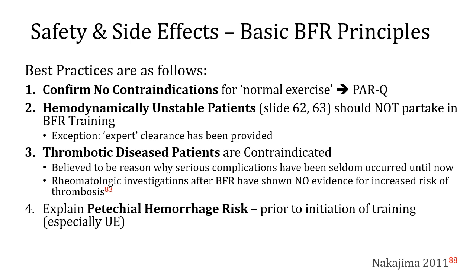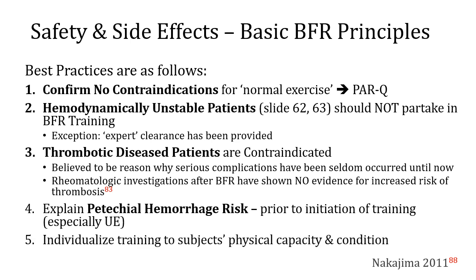Explain that there are side effects, particularly petechia and hemorrhaging, which is like the bursting of small blood vessels beneath the skin directly underneath the cuff, as well as the expectation that there's going to be pressure on the cuff. Sometimes people can get a little bit of tingling within the limb. It will likely change color. It will likely swell. These are all normal and healthy responses to blood flow restriction training that will immediately resolve upon reperfusion and releasing the pressure.